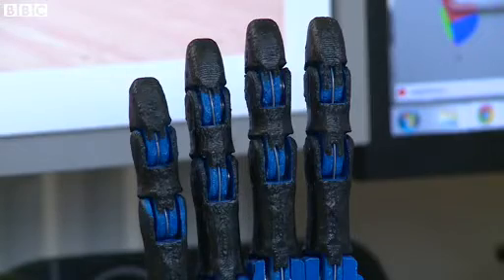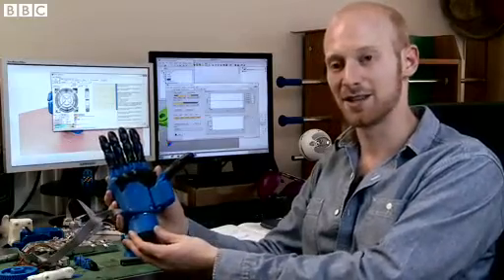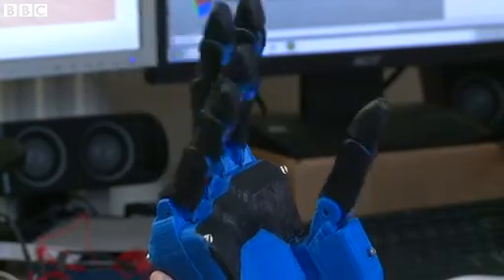This is the Dextrous Robotic Prosthetic Hand and it's a low-cost robotic hand made out of 3D printed plastic. I can close the fingers and as one becomes impeded it will stop trying to close. A nice test of this is using an egg because it's a delicate object and it's also quite a strange shape.